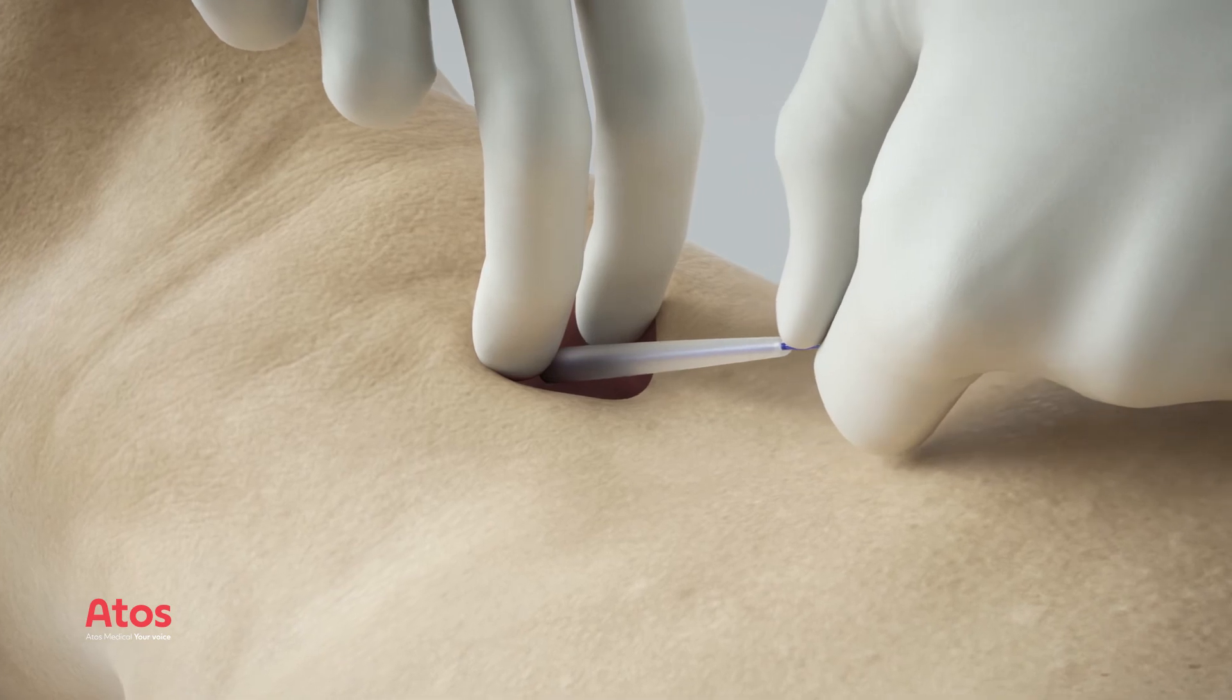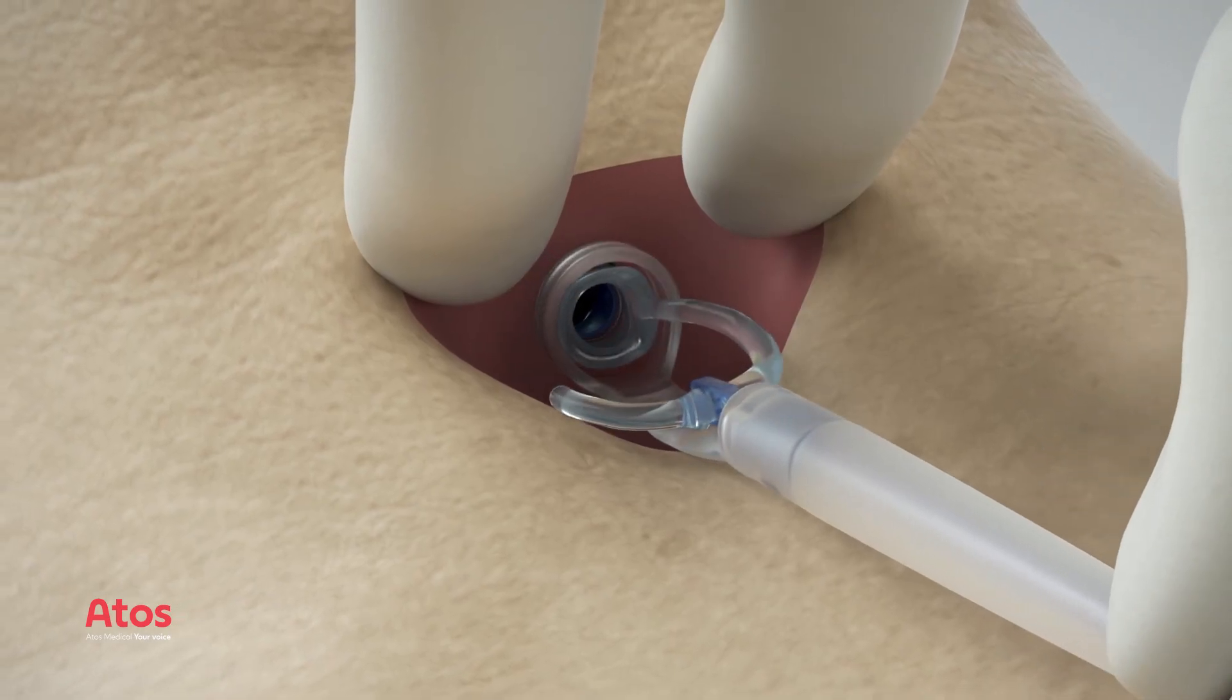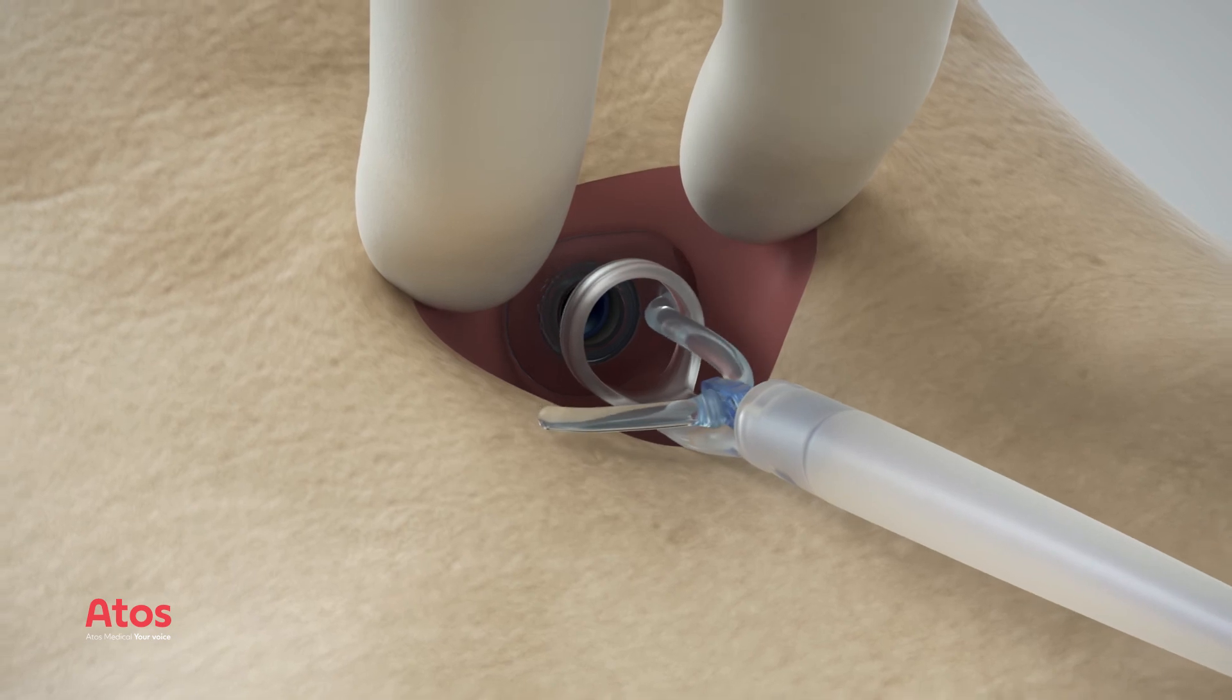Carefully pull the guide wire until the tracheal flange of the voice prosthesis is unfolded in the trachea by the dilator tube.